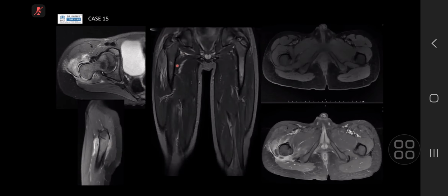Now, things to be aware of is in a kid, in osteomyelitis in adults, your T1 is your friend, because focal areas of low T1 signal suggests a marrow process, which can be infection or malignancy, and it should be lower. So iso or hypo-intense to muscle, which suggests it's a marrow abnormality on T1. But in kids, we've got red marrow, which makes things a bit difficult. So T2 is your friend.